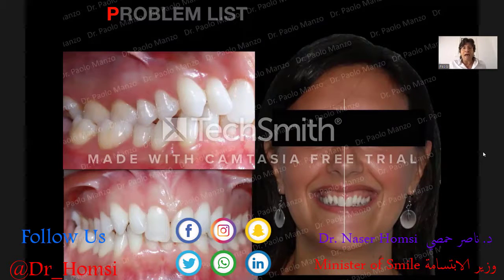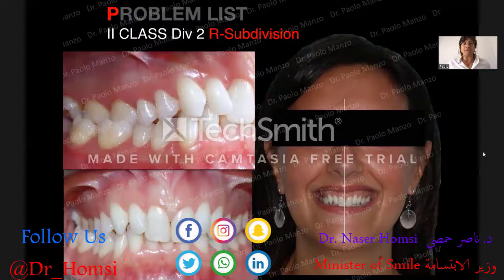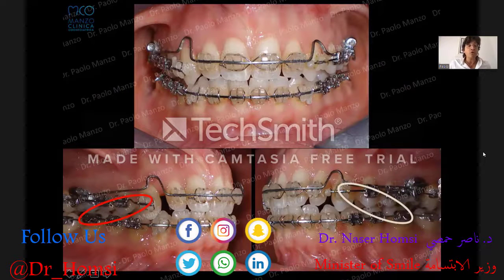And also now I have to correct the dental midline discrepancy. The discrepancy of the upper midline with the face, a small discrepancy on the left, was corrected also with the elastics. And this is very much in agreement with the diagnosis, because we have a diagnosis of class 2 on the right, dental midline discrepancy on the left, at the upper. So we can correct with continuous class 2 elastics, full-time on the right, and half-time on the left.